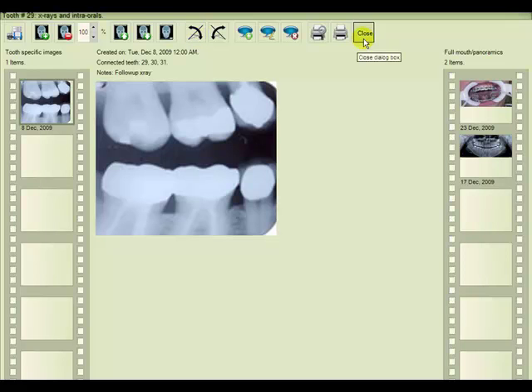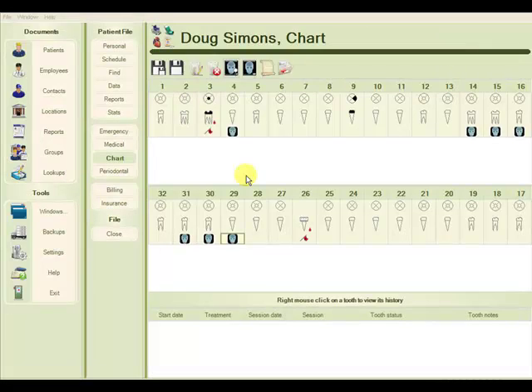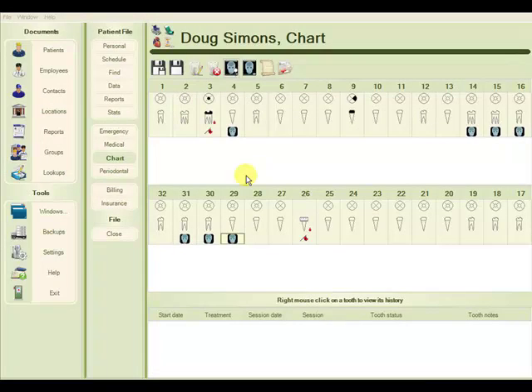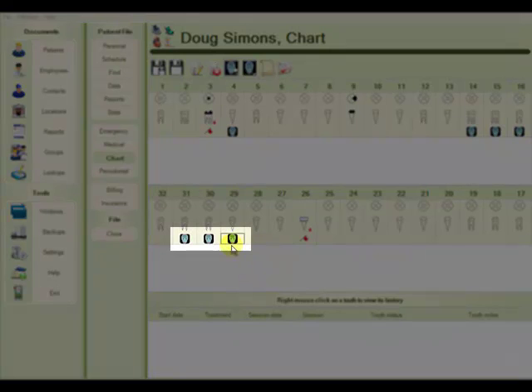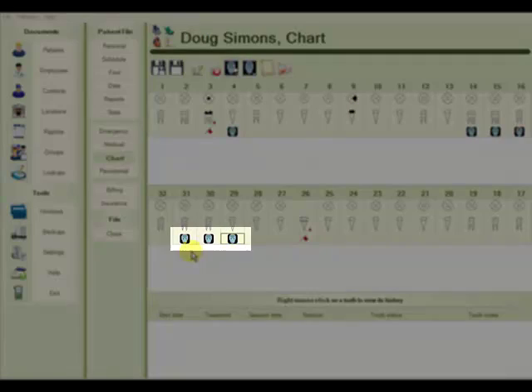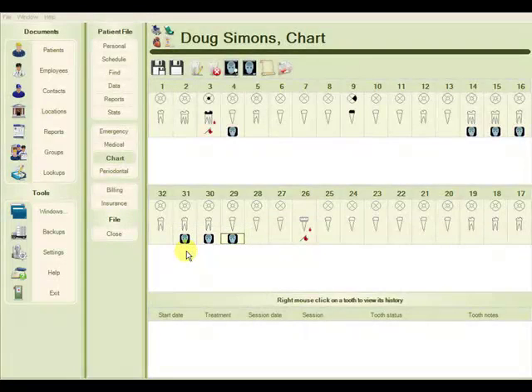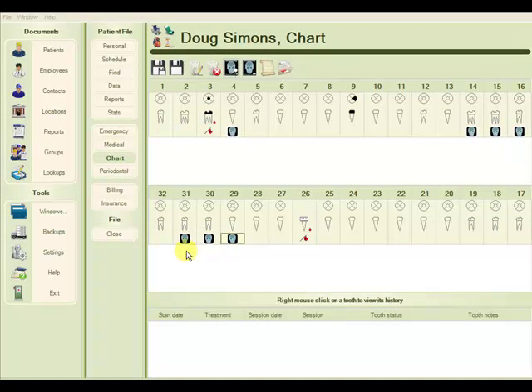So now that we have imported this X-ray, we'll close this window. And looking at the patient chart, we can see that an X-ray icon has been added to the chart on teeth 29 to 31. This X-ray icon will only show up for tooth specific images and not for panoramic images, as of course the icon would then be ambiguously displayed on every tooth.